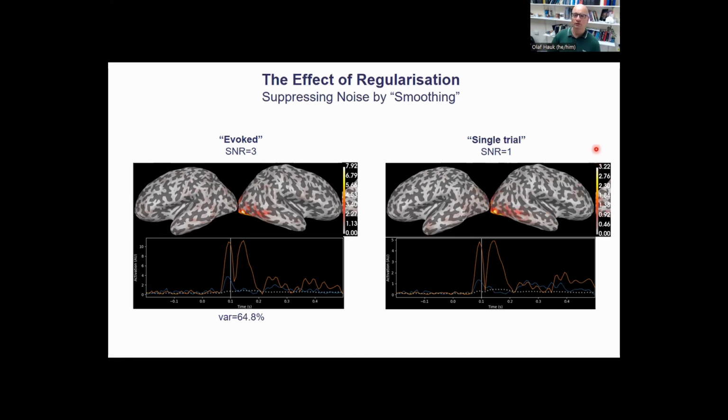So we did smooth our data. We are now spending, let's say, less power to explain our data. We leave more unexplained. If we look at the signals in source space, again, smaller scale, but flat baseline, the evoked responses are still there, but the time course has changed as well. So for example, look here. These peaks are smaller than those peaks. Here they're a little bit larger even. So things have changed. It's subtle, but it's there.